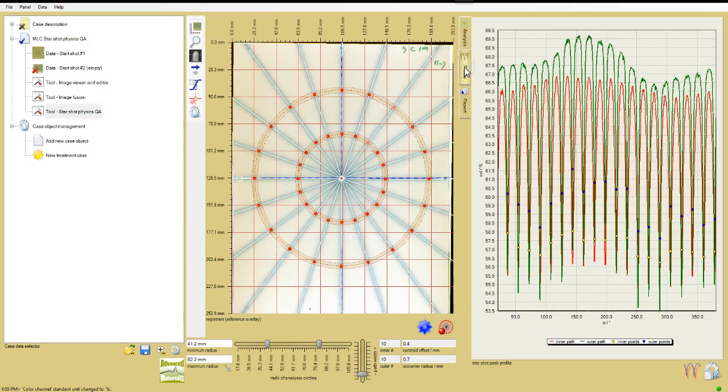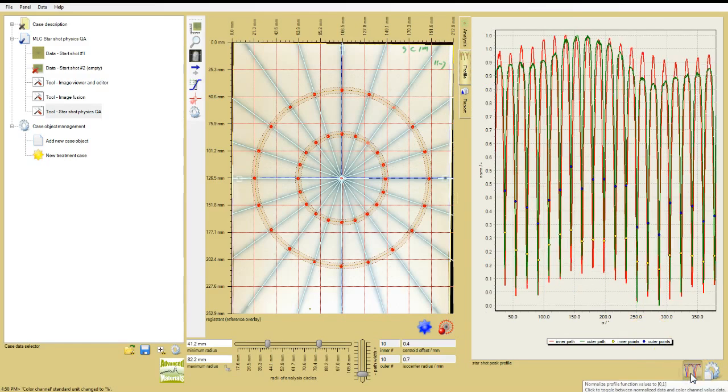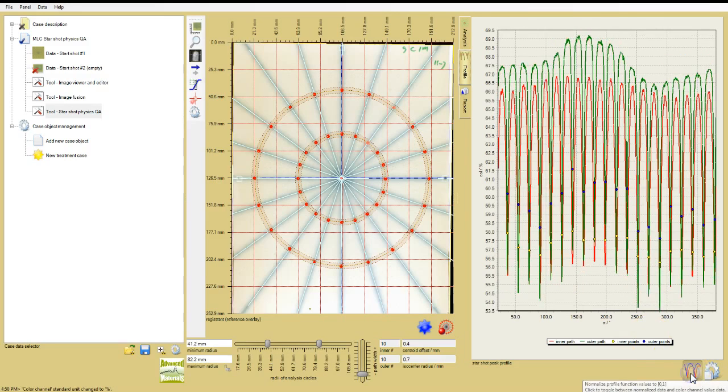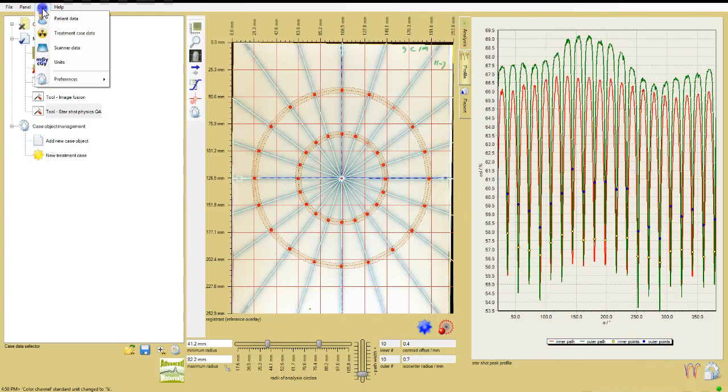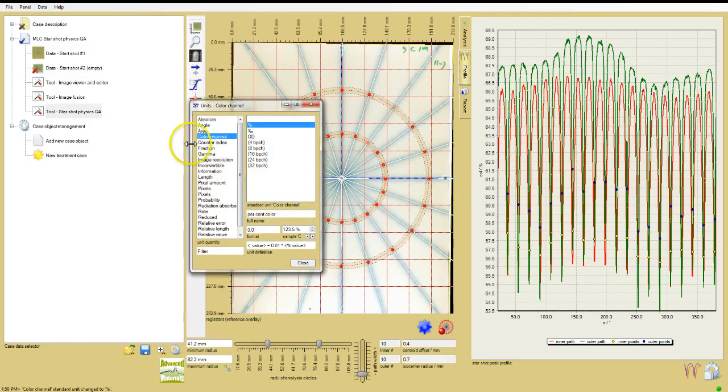Click the profile tab to display the profiles along the paths as well as the locations of the intersection points. Use the normalize function icon below the chart to toggle between absolute and relative response values. To change the absolute response units, go to the main menu bar and under data, choose units, and then select the desired value.